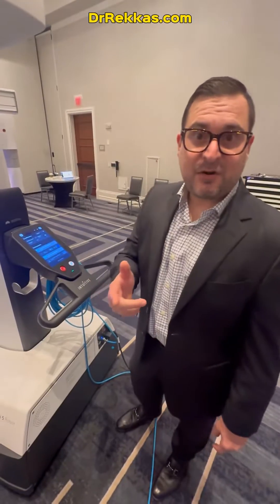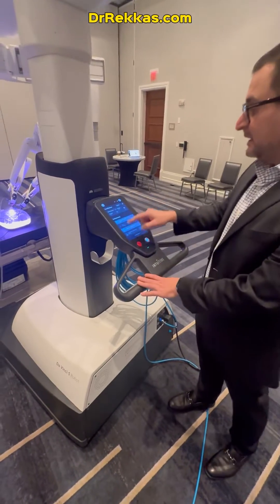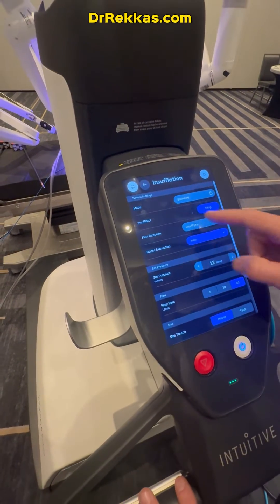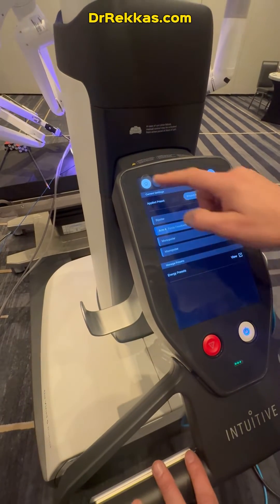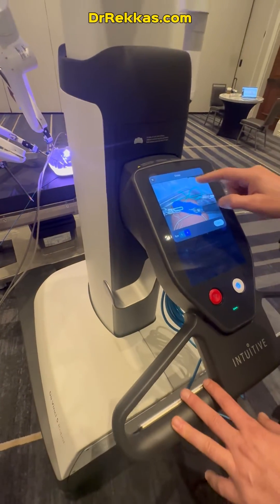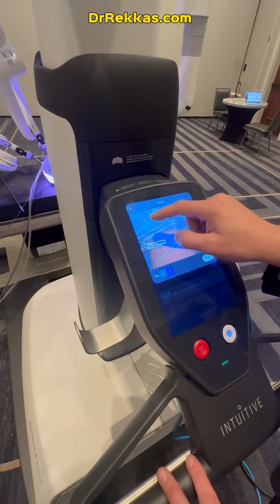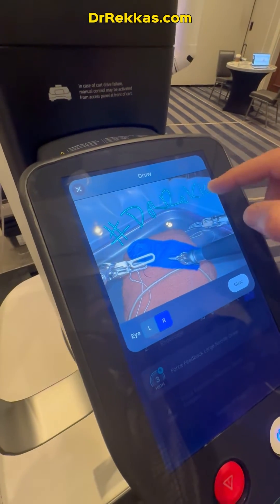Let me show you the patient cart on the DaVinci 5. This is really upgraded. There's a whole screen here that's very intuitive. If you click on here, you can see there's images that are going to help your staff make changes — you can change insufflation, you can change the energy settings. You can also do telestration: you can draw on here to help people with their cases. The telestration on this is much, much better.